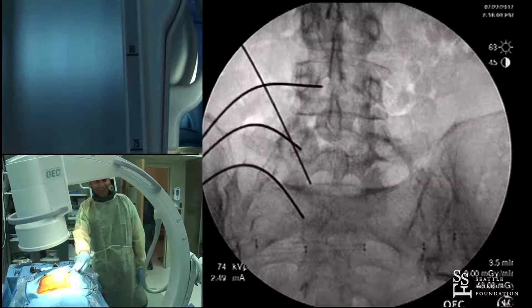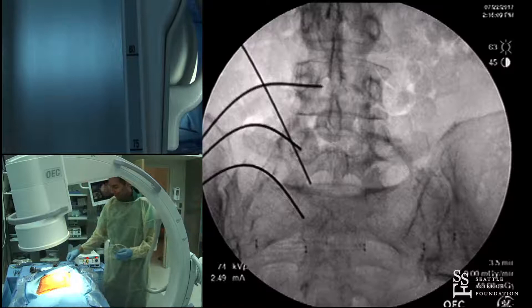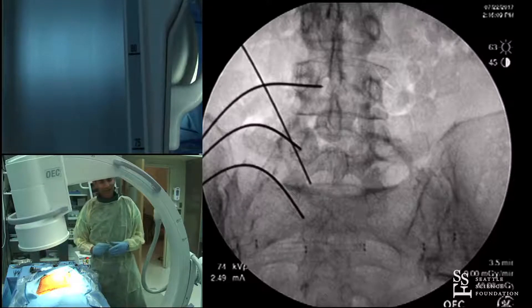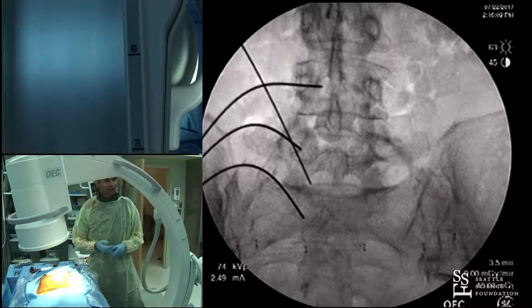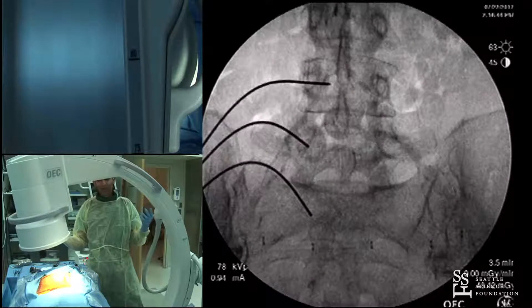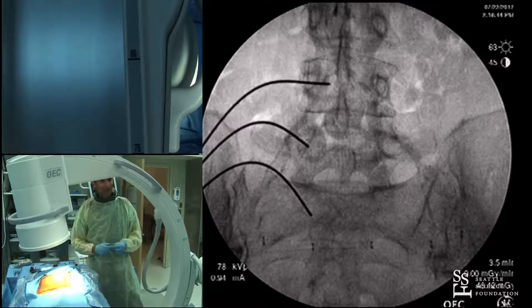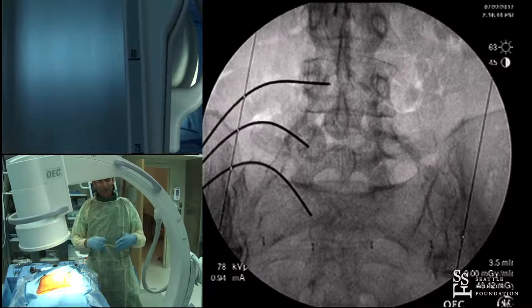Dr. Singh's guide wire at S1 is not into the interlaminar space — that was his navigation. I'm very neurotic about my OR setup regarding radiation. This is just about screw passage and rod passage, but there are things you can do to reduce your radiation exposure. Number one: go to low dose on the fluoro — there's zero reason why not to. Picture quality rarely changes with low dose in 95% of patients.